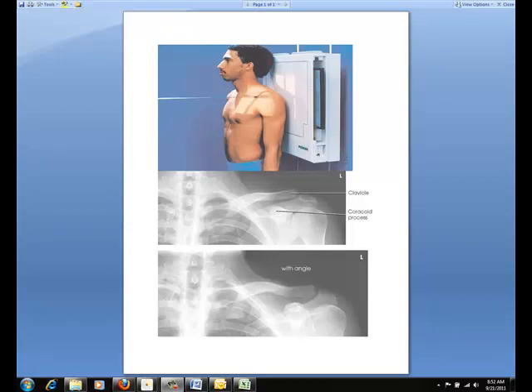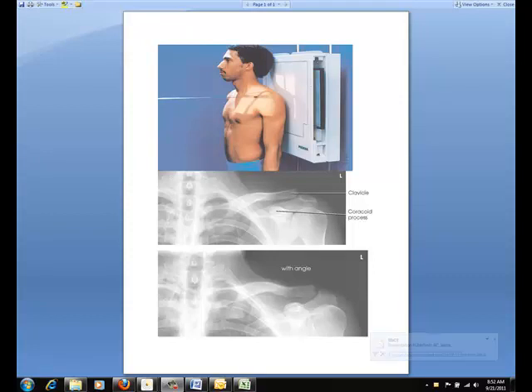For positioning, adjust the body so the center of the clavicle aligns to the midline of the table or vertical grid device. Place the arms along the patient's sides. Center the clavicle to the IR. For respiration, suspend at the end of exhalation to obtain a more uniform density image. The central ray should be perpendicular to the mid-shaft of the clavicle.